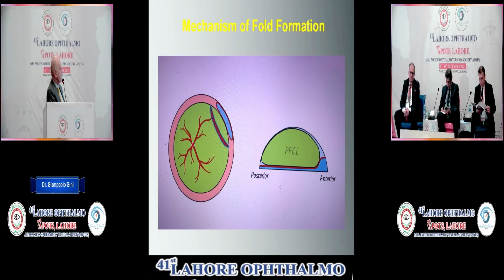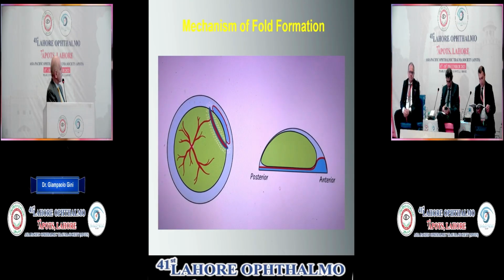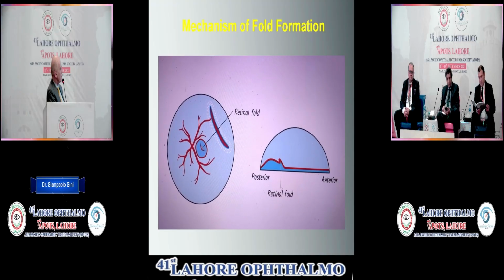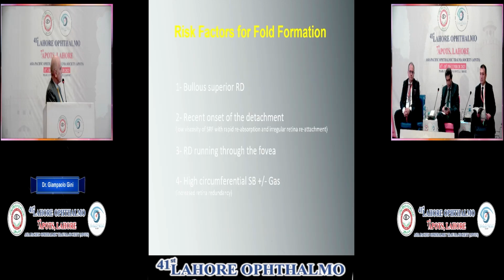Here it goes. And you can see how this fold simply forms because of the fluid underneath the retina being pushed towards the center of the retina itself.